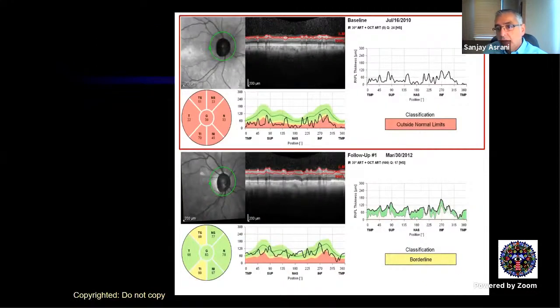And this is what one of you, I think, was it Shruti or Sanjana, I don't remember, described in uveitis, how this nerve fiber layer seems to have grown. So you can see a lot of green is because this patient who had a total cup developed uveitis and now developed nerve fiber layer edema. So use OCT with extreme caution in anybody who is post-op, within 6 months of surgery, within 6 months of an intervention, and or has uveitis.